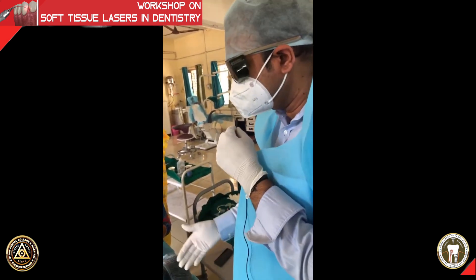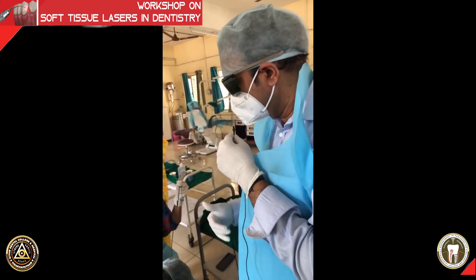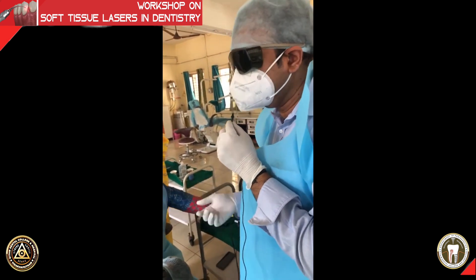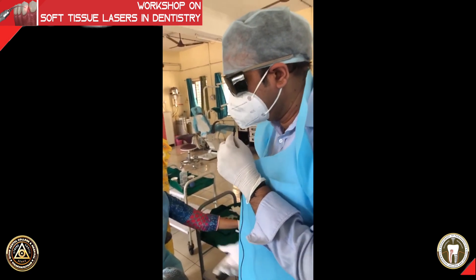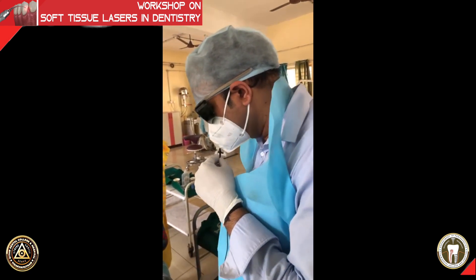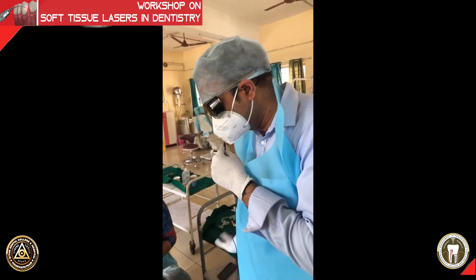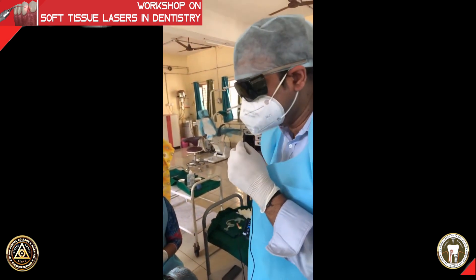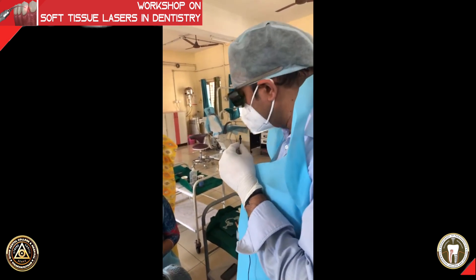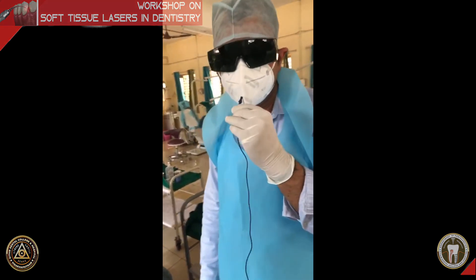With this, we complete the procedure. After this, we will just do a subgingival irrigation and you can send the patient. If you want, you can do one round of scaling just to remove the dye, and then send the patient. This is non-surgical therapy — it is a cold laser because we use less than 0.5 watts, or less than 500 milliwatt. This is photodynamic therapy. Thank you everyone.